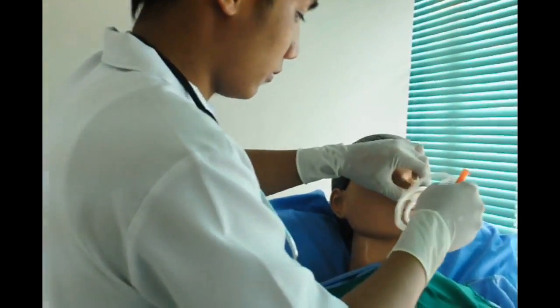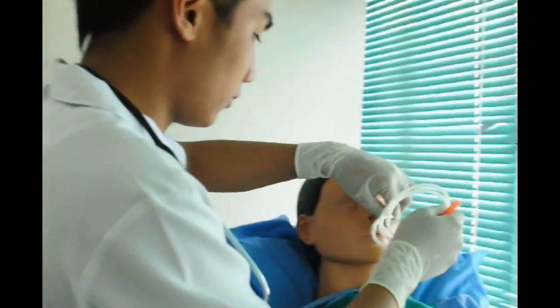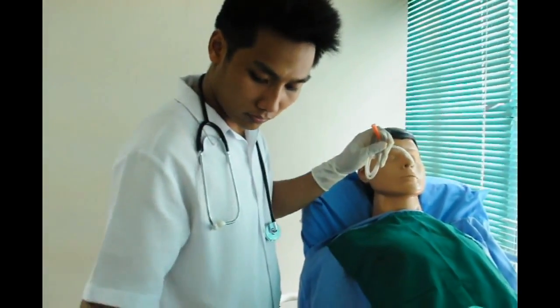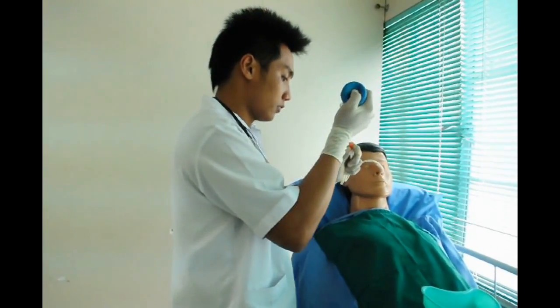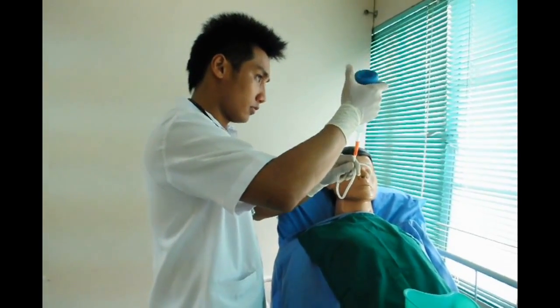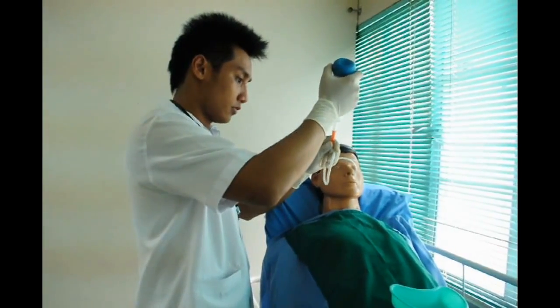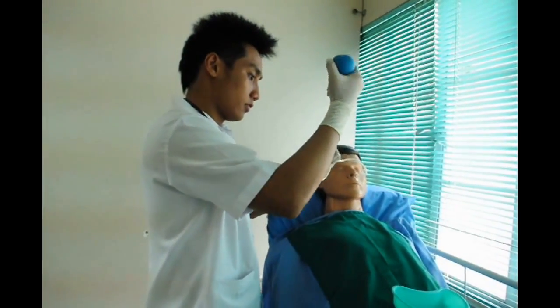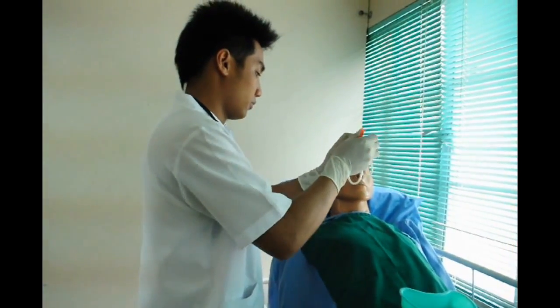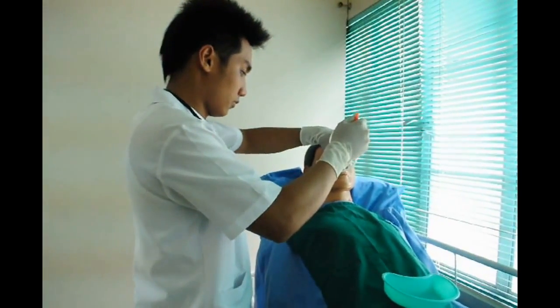While keeping one hand on the tube, determine the placement of the tube. Attach a syringe and aspirate a small amount of stomach contents. Keeping one hand on the tube stabilizes the tube. The tube is in the stomach if the contents can be aspirated. Measure the pH of the aspirate. The pH is acidic. Obtain an X-ray of placement of the tube as ordered. X-ray is considered the most reliable method of identifying the position of the nasogastric tube.